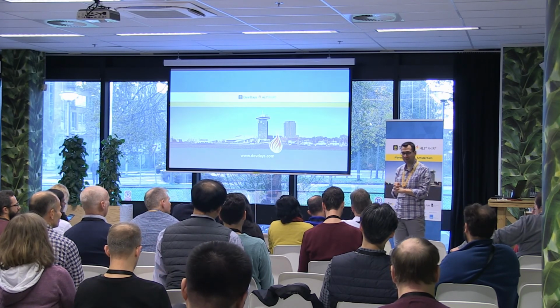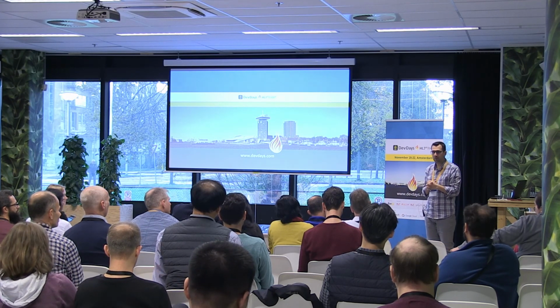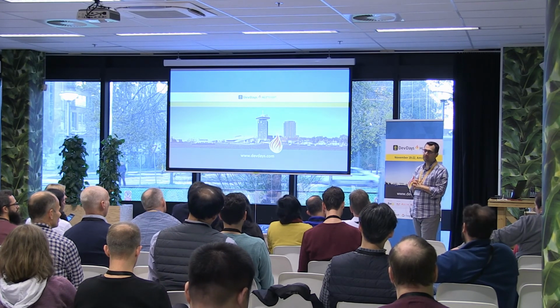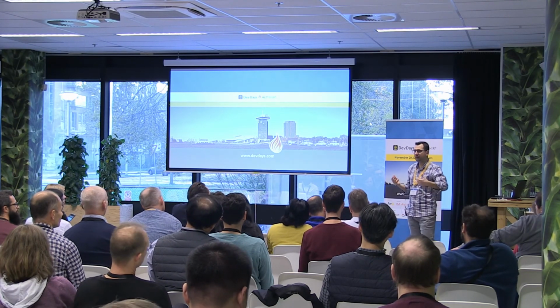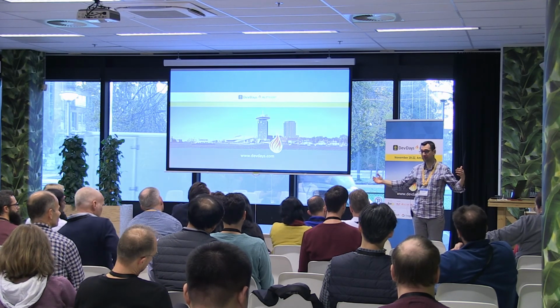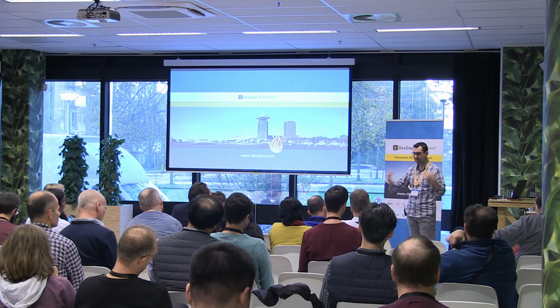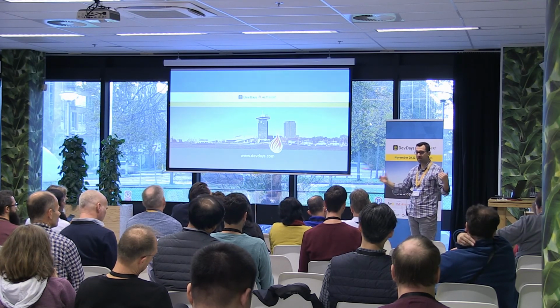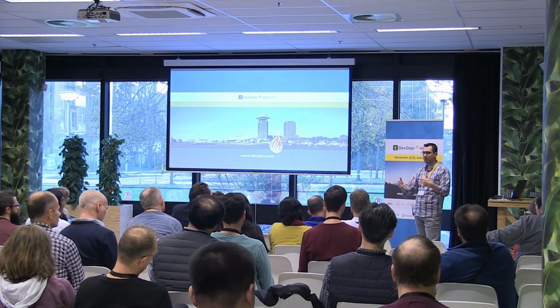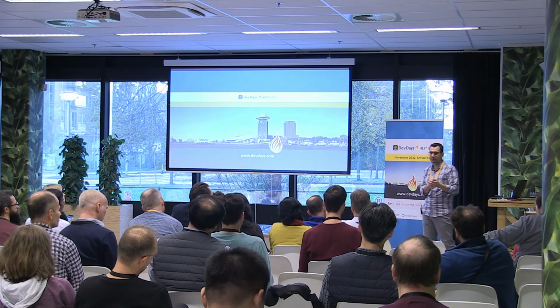In part, I was thinking maybe FHIR is a good new alternative for what DICOM SR tried to solve, right? Yes, you could definitely say that. That being said, the reality to keep in mind is that a lot of these machines have a really long lifespan. Ultrasounds maybe not so much, but the bigger machines like a CAT scanner stay there for 10, 20, maybe even 30 years. So retrofitting them with something modern like FHIR may not always be easy, but retrofitting them with just a new flavor of DICOM is sometimes a lot easier.